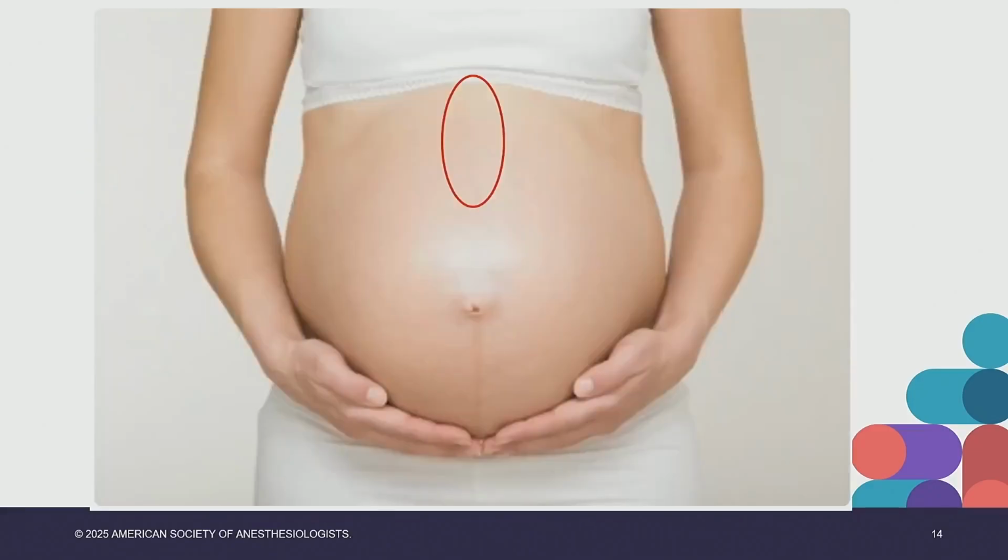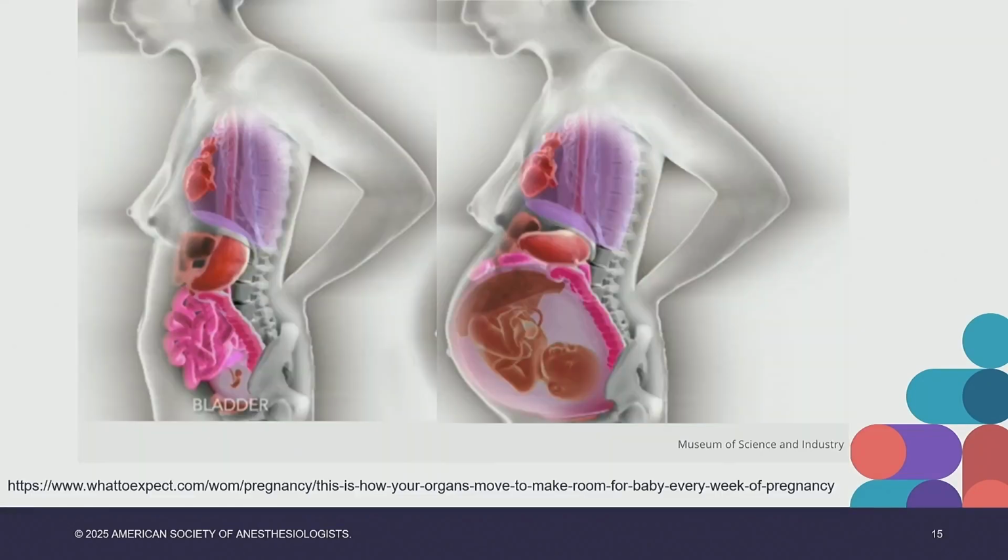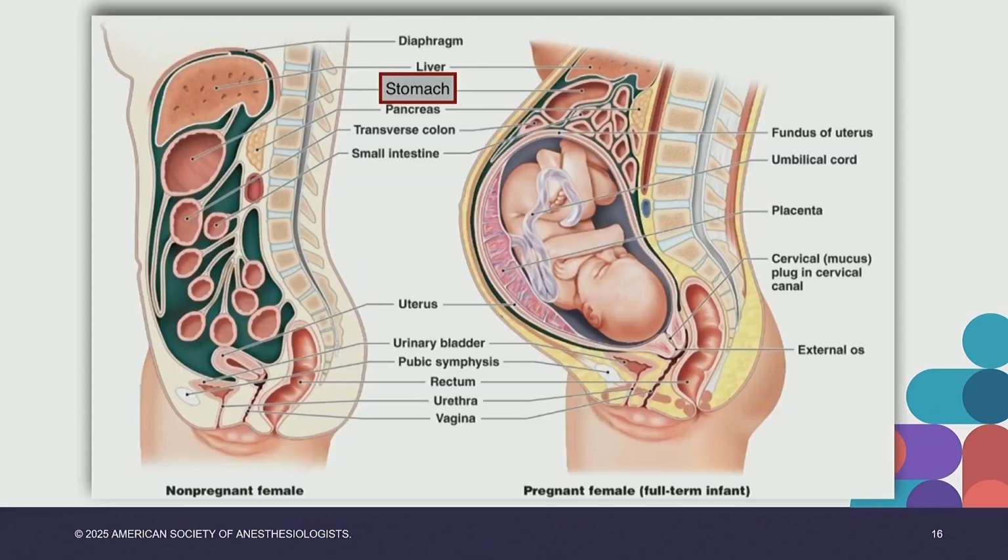Okay, this is the epigastric view. It's a challenge in the pregnant woman, and Clemens showed us that even cardiac can be done, but it's difficult, challenging. These are pictures that we have on the educational website. Nice picture. I like to use this one where the baby is actually pushing the stomach upward, so it's a difficult epigastric probe placement, steep angle. And the protocol is probably more difficult. The uterus is moving, it's a moving fetus.